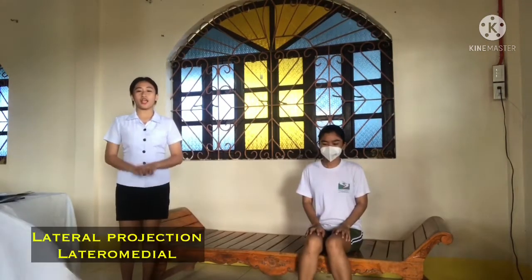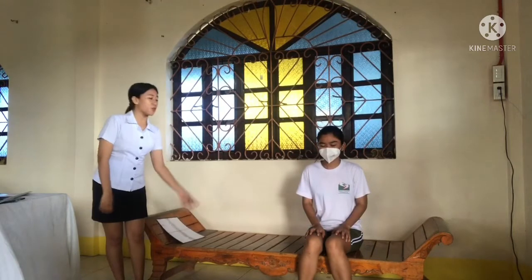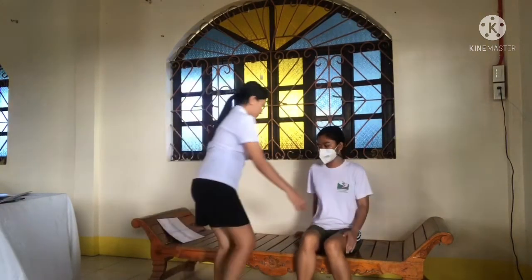Next, the lateral projection lateromedial. So, the IR used must be 24 by 30 cm lengthwise. So, position of the patient, supinate the patient, turn the patient into the unaffected side until the affected leg and foot are laterally placed.